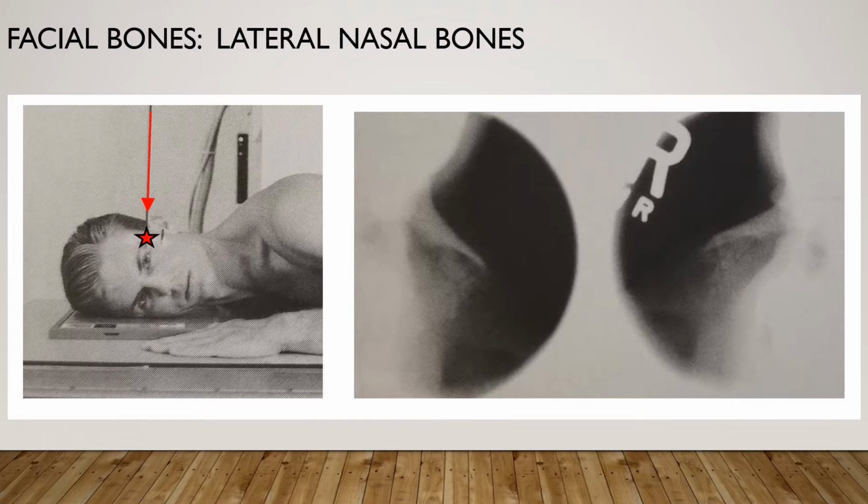As you can see in this photo, the patient is going to have their head right up against the IR, so this will be a tabletop exposure. Typically, you're going to select a finger technique, so if you normally take a finger x-ray at maybe 55 kVp, 1.5 mAs, then that's what you will use for each of these pictures. You want to have the patient semi-prone or seated erect. You want to center the nasion to the IR. Please remember the nasion is above the nose.